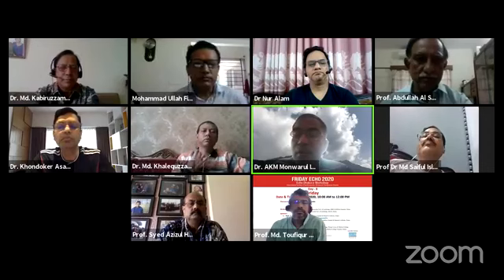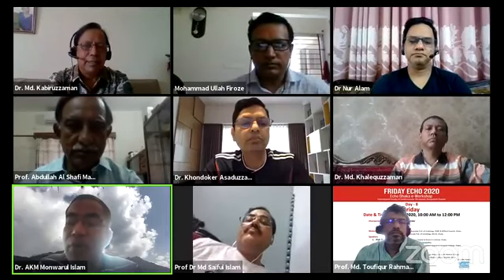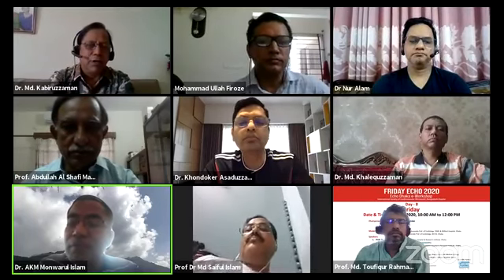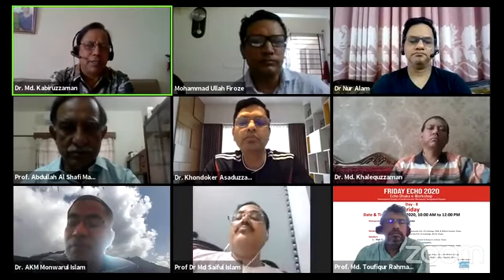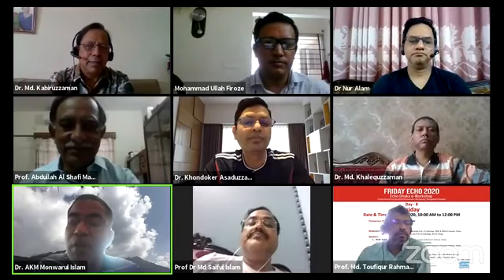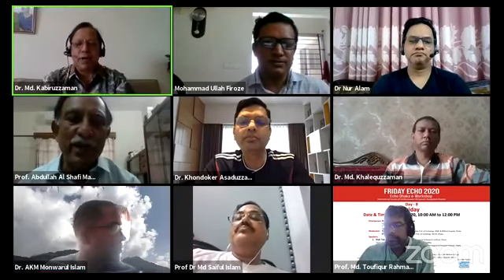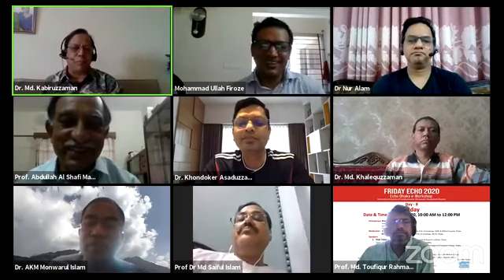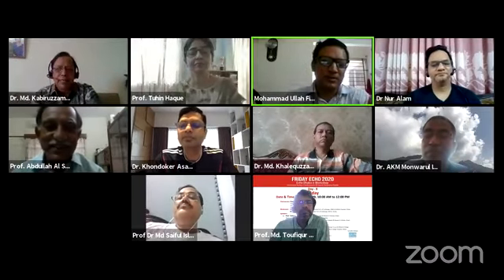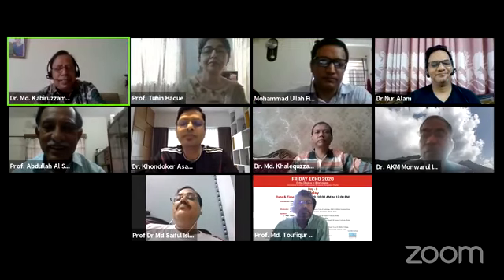Thank you, sir. What are the additional points that should be mentioned on echo before aortic or mitral valve replacement? Additional points in pre-surgical echo, what points should be mentioned? We are talking about after replacement. Okay, before is an important one.